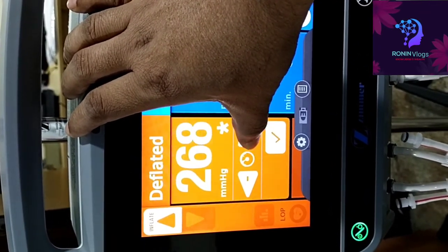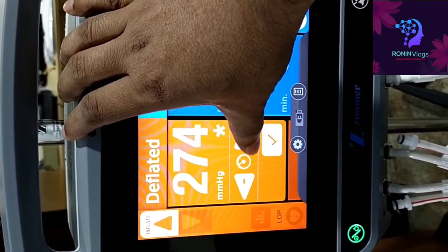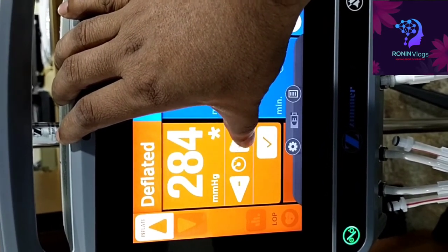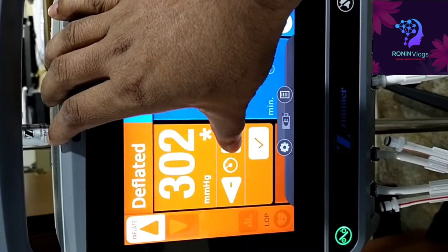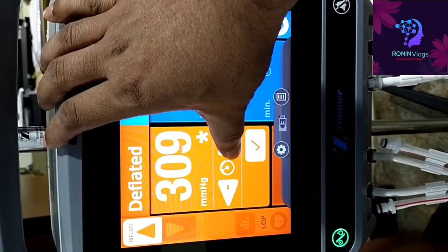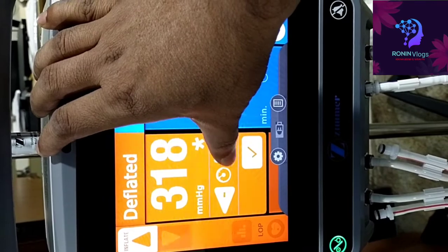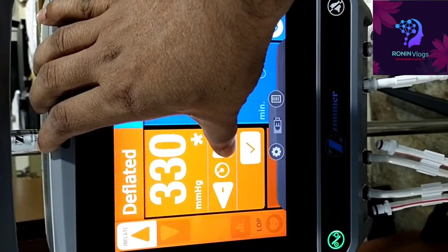Main use during the surgery, the blood flow we need to stop. That time we are using this one. Mainly use for the ortho cases. During the surgery, when we need to stop blood flow to the surgery area, that time we are using this tourniquet.